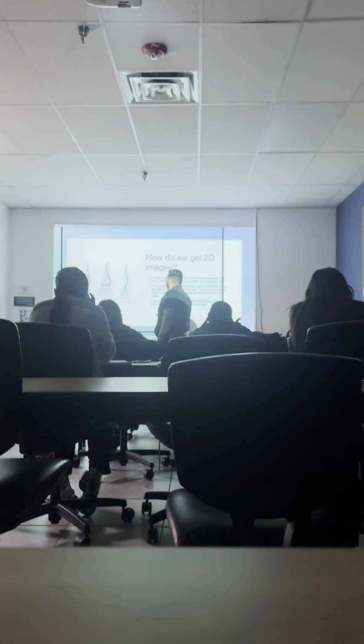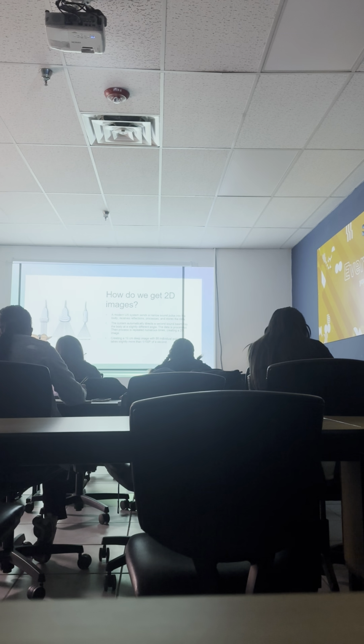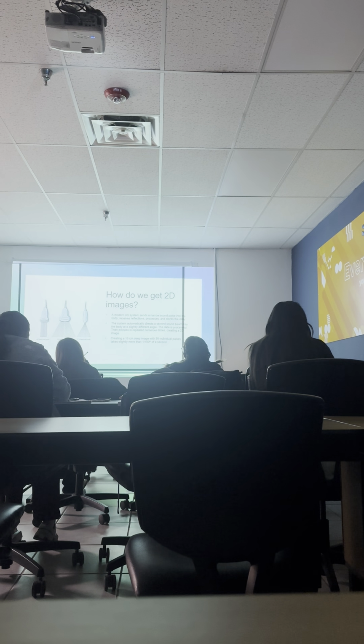So each of these lines represents information that is sent by this individual crystal, okay? So this individual crystal has its own information, okay? The machine processes this single line of information and puts it together for us as an image on the ultrasound screen.